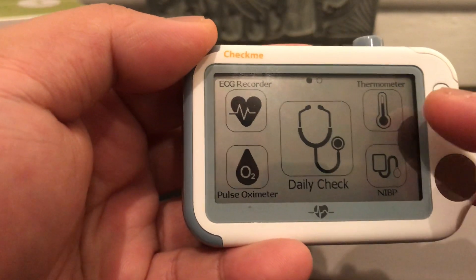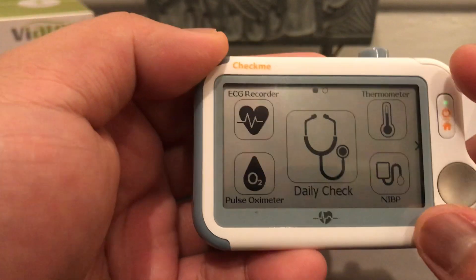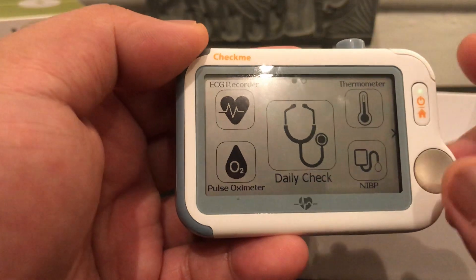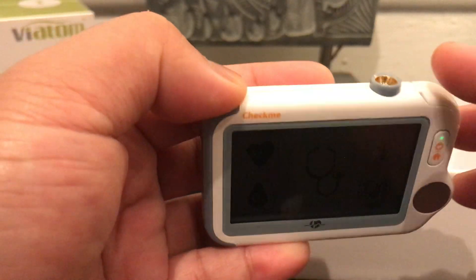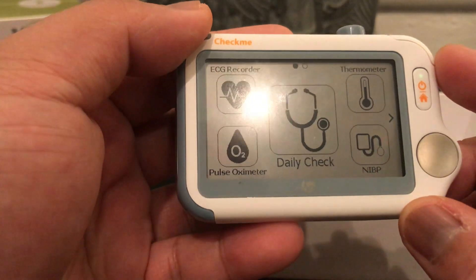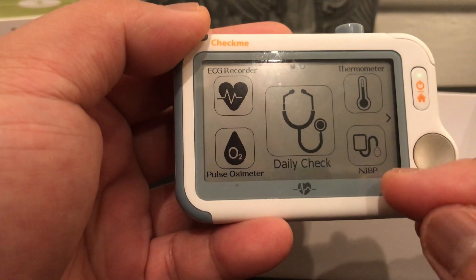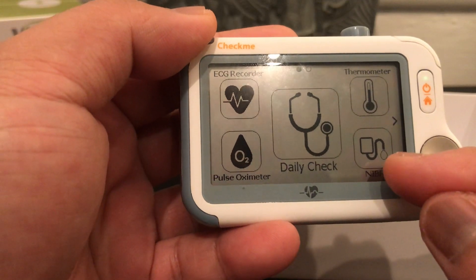For temperature, simply press this icon — we're not going to do this demo right now — but place this sensor on your forehead, click the button, and it'll check your temperature. This icon down here is a connection for your Bluetooth blood pressure device, which is sold separately.